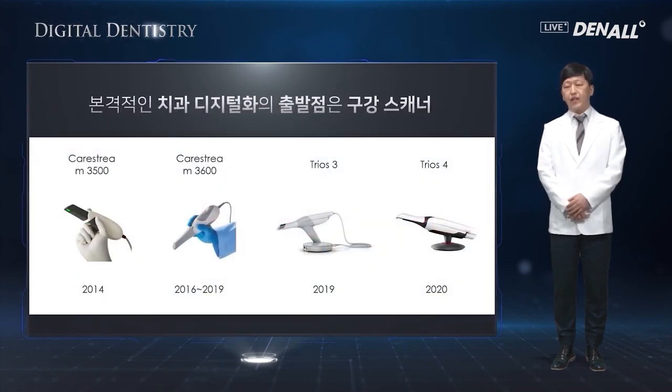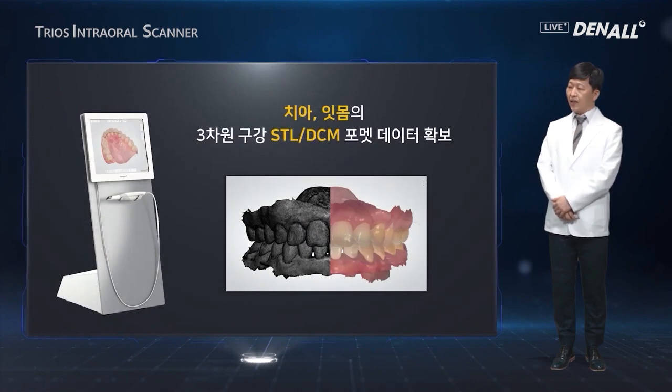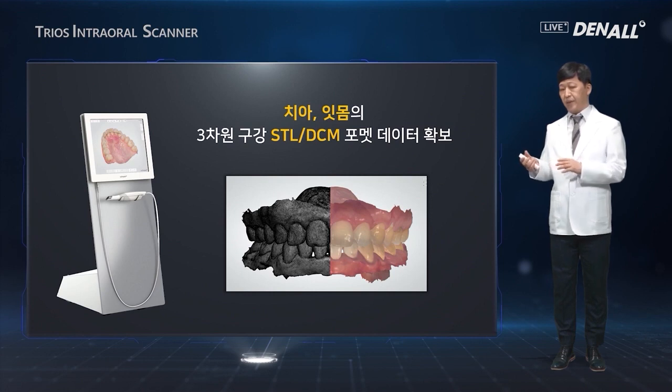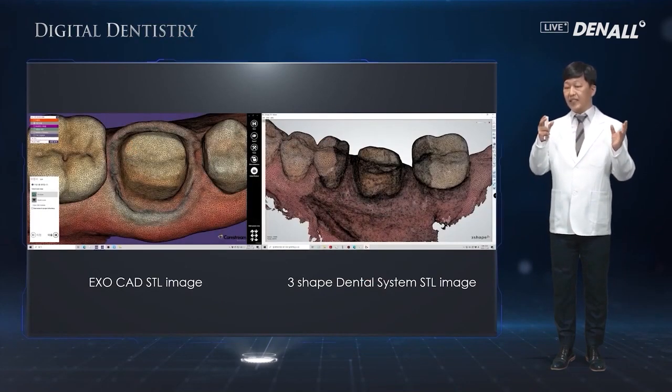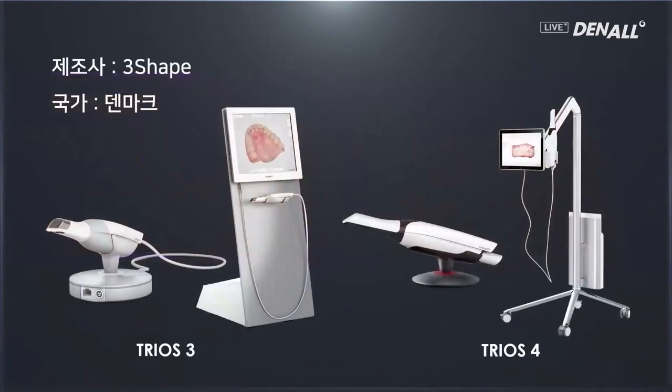Up to now, I have used many different intraoral scanners. The scanners, whatever they may be, their output is in the form of triangular mesh structure. So the image output data in the form of STL file can be brought in to the design programs such as ExoCAD or 3Shape program. They represent the scanned images in the triangular mesh structures. So with this, we are doing the design.